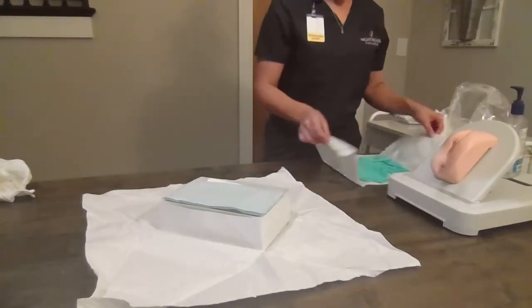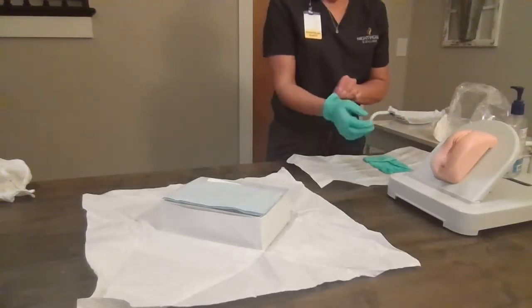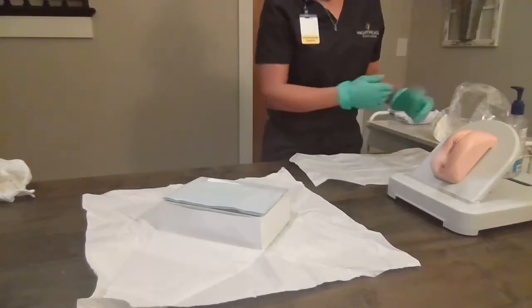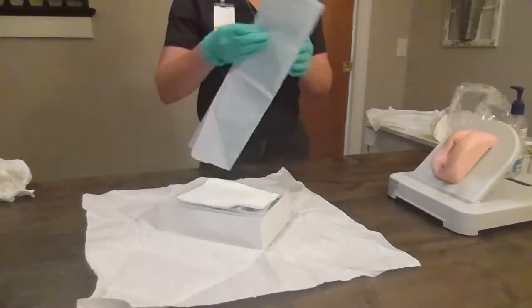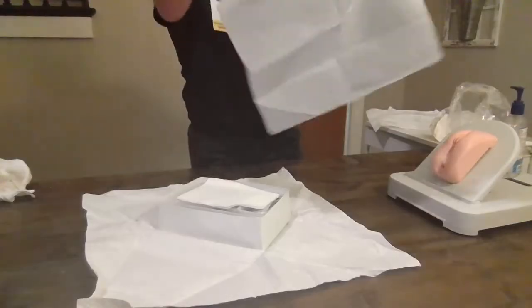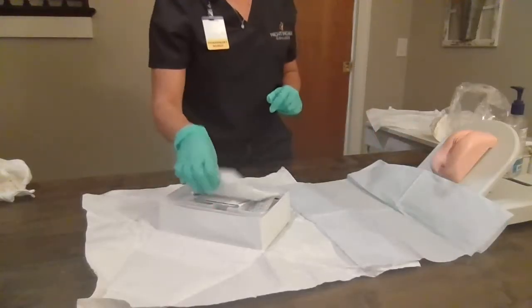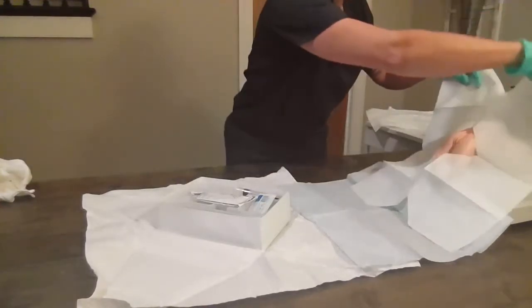We're going to apply our sterile gloves. I was sure to remove any rings or watches prior to this procedure. I'll pull out my drape. Ms. Smith, will you lift your hips up? We'll slide it under her. I'm going to drape over.